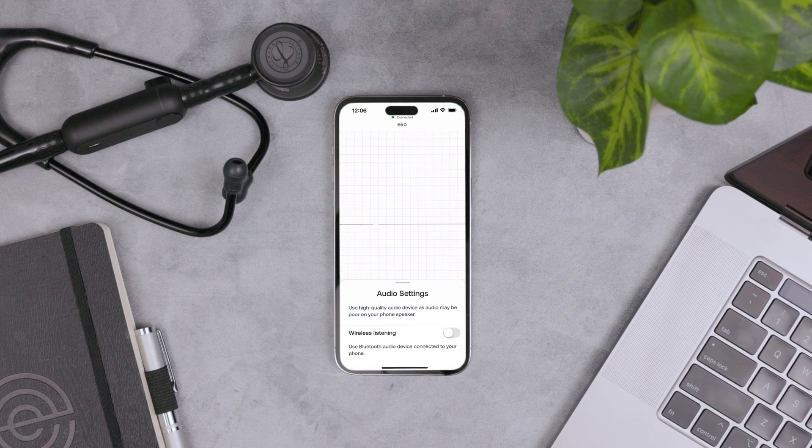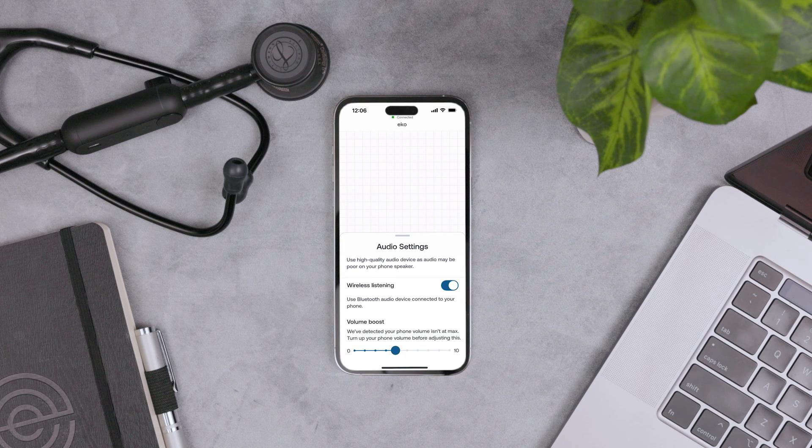Tap the Headphones icon to start wireless listening. In Audio Settings, turn on Wireless Listening. This lets you play sound from headphones or hearing aids.